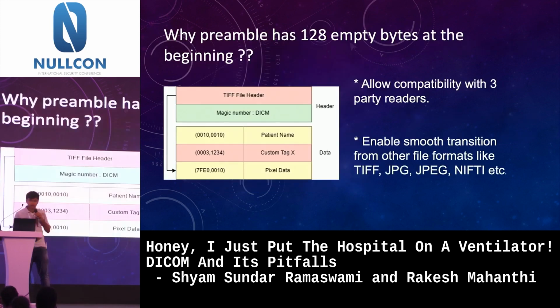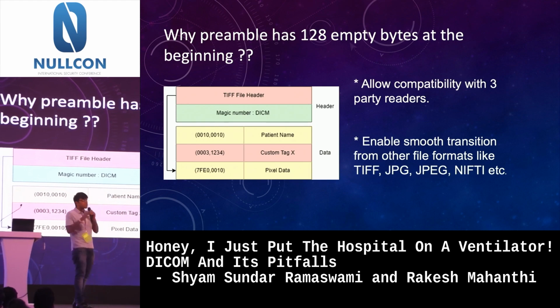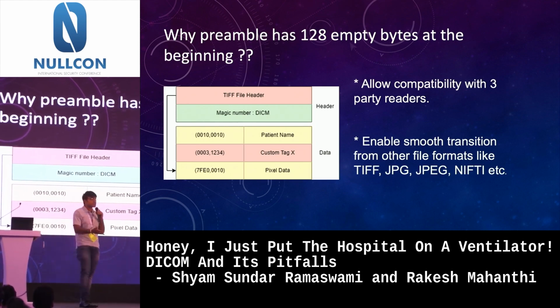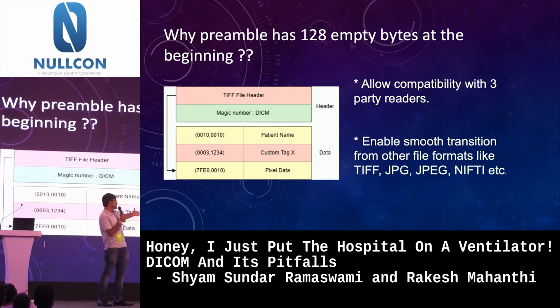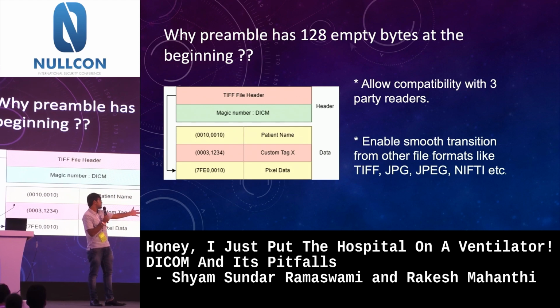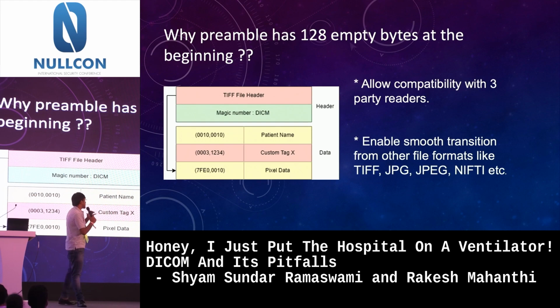So let's move on. Let us first try to answer the question why 128-byte has been intentionally left empty. Previously, when the DICOM standard had not come into the picture, there were other file formats which were very prevalent in the healthcare industry, like Tagged Image File Format, TIFF, JPEG, JPG, and all these things. So DICOM standard wanted to onboard all these other file formats into DICOM format in a smooth way. In the sense, let's say your hospital is depending on TIFF files in the pathology section, and you want to convert those TIFF files into DICOM files.